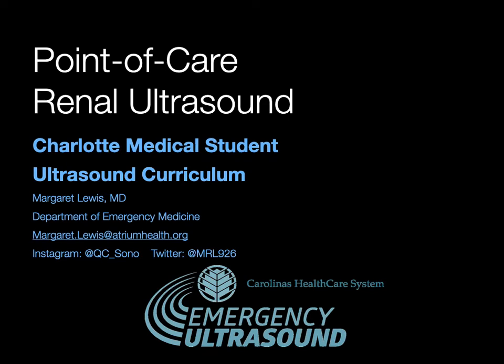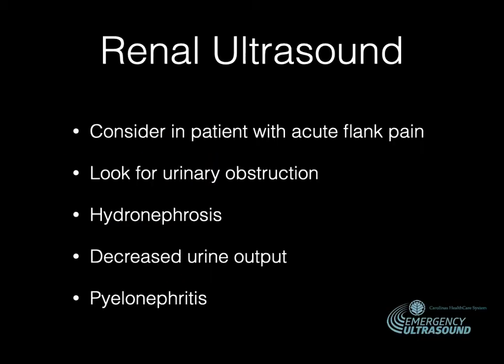Today we're going to talk about point of care renal ultrasound. So you might be asking yourself, when and why do we use a renal ultrasound? What are we looking for? What patient are we thinking about looking at the kidneys on?